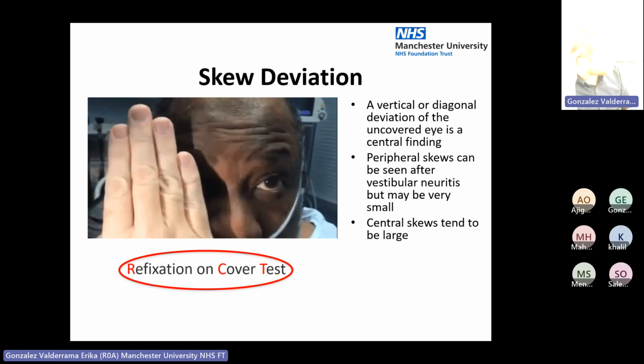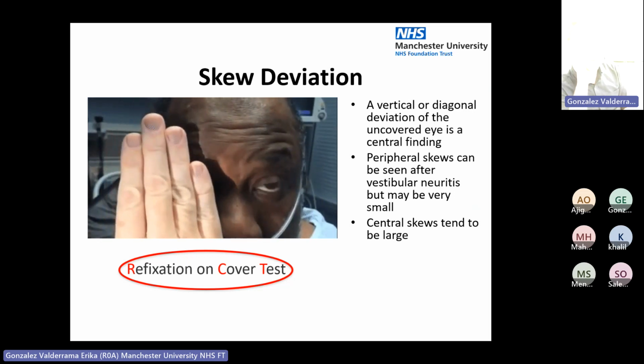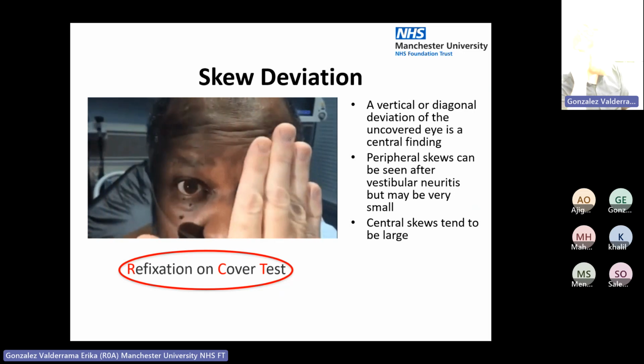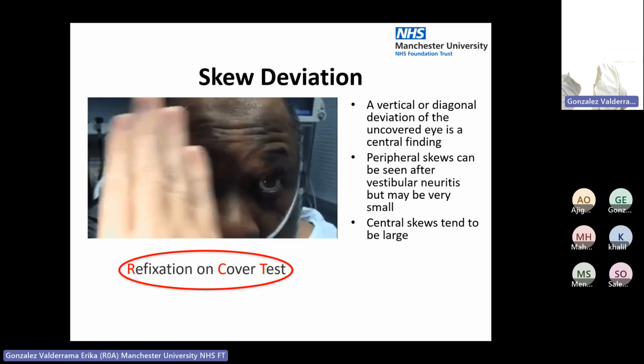Now, this is something that's not really practiced much outside of ophthalmology and neurology, and I don't think anyone is necessarily expecting ENT trainees to be happy doing skew deviation.